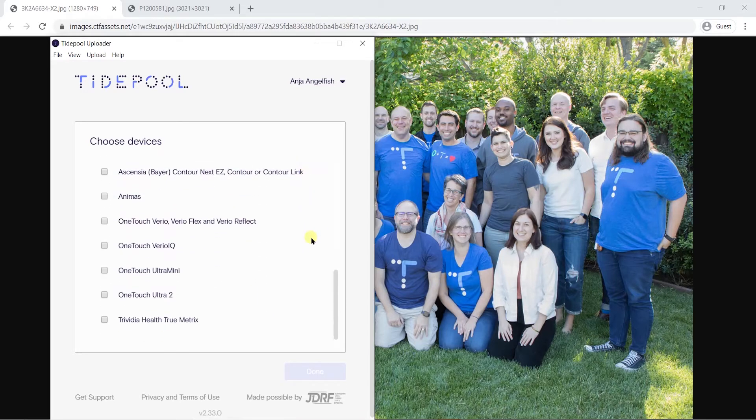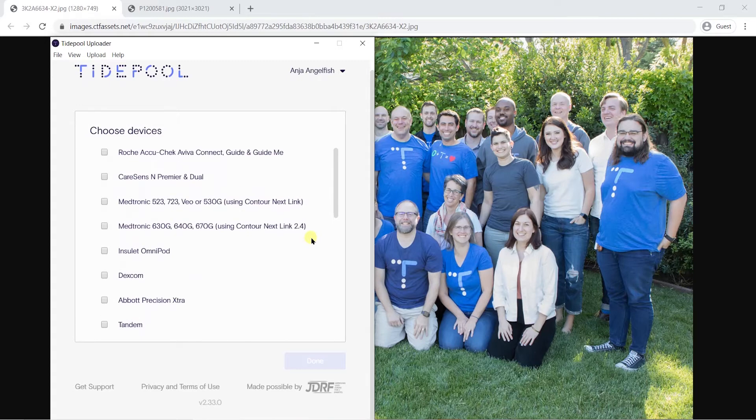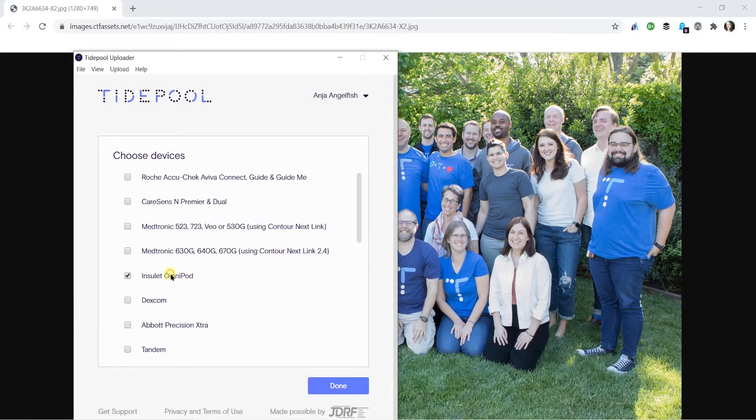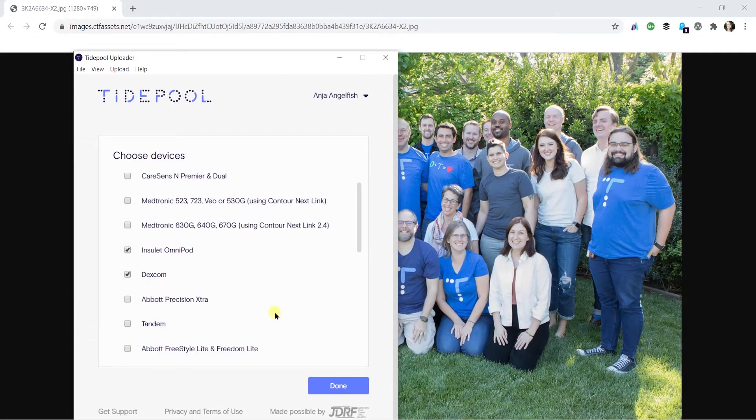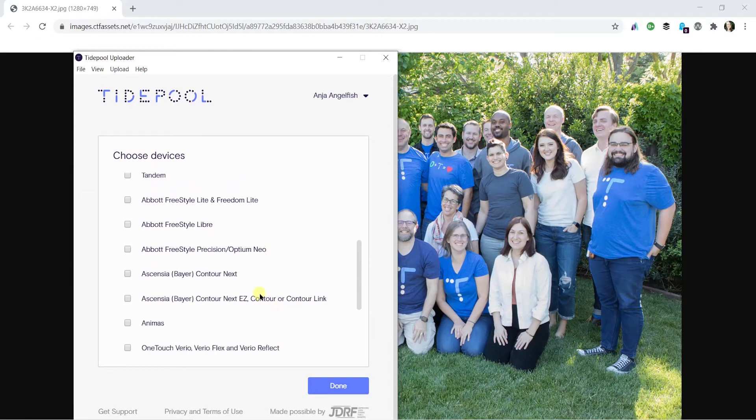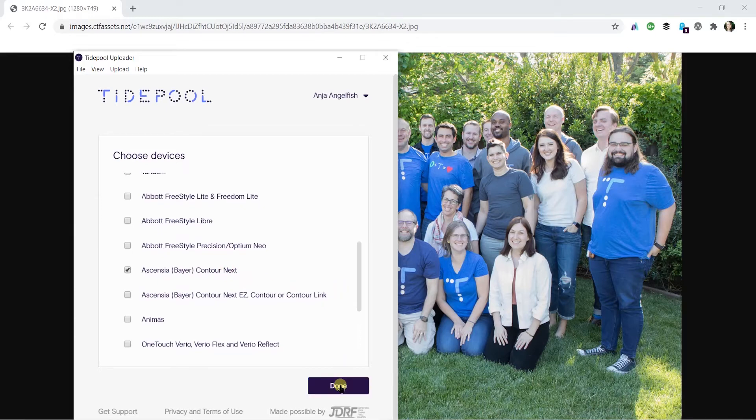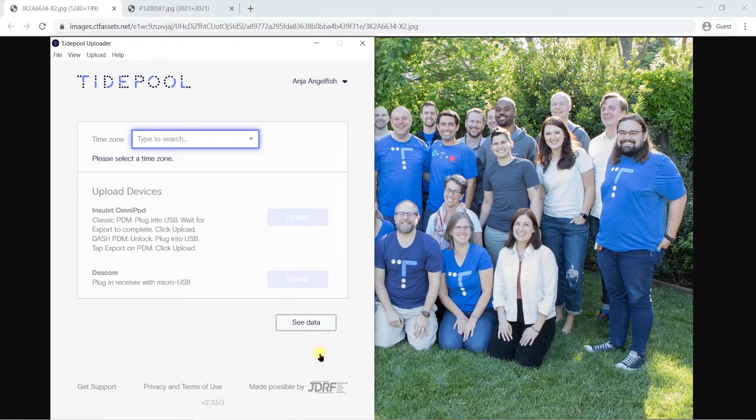If you don't see one of your devices in the selection menu, contact us at support at tidepool.org. We're working to add more supported devices, and your feedback helps us prioritize how we improve our software.